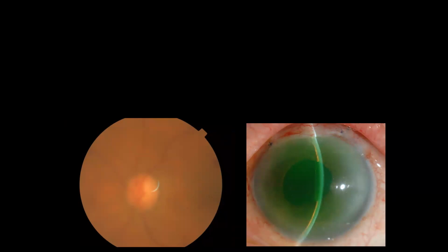You will look for any choroidals, and you will look for a baseline B scan with gentle pressure if you are not sure about the existence of peripheral choroidals, and you might need to use something else along with B scan. UBM. Excellent. Looking for what? Anterior rotation of the ciliary body. You want to discriminate between anterior rotation and annular ciliocoroidal effusion. Yes. And also, I think the presence of PI, whether it's present.